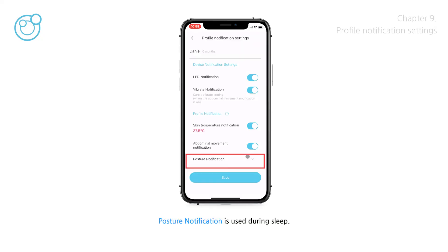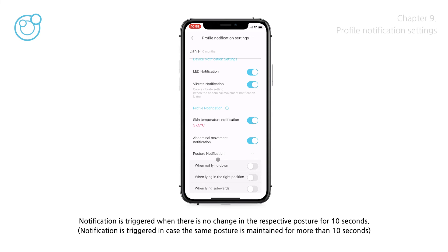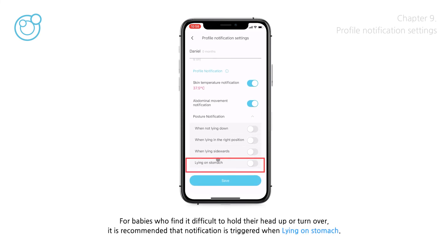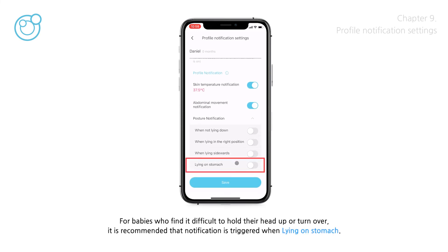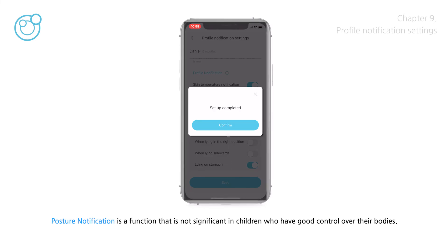Posture notification is used during sleep. A notification is triggered when there is no change in posture for 10 seconds. For babies who find it difficult to hold their head up or turn over, it is recommended that notification is triggered when lying on the stomach. Posture notification is not significant for children who have good control over their bodies.